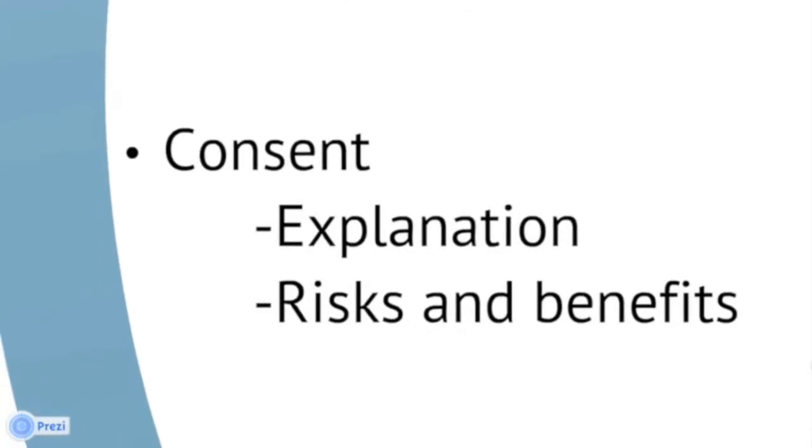Once you have done this, move on to gaining informed consent. In order to do this, you should provide the patient with a simple explanation of what you are going to do and why. You should also describe the potential risks, for example infection and expulsion, along with the benefits such as emptying the bladder or measuring urine output. After this, check the patient's understanding and ask if they are happy for you to continue.